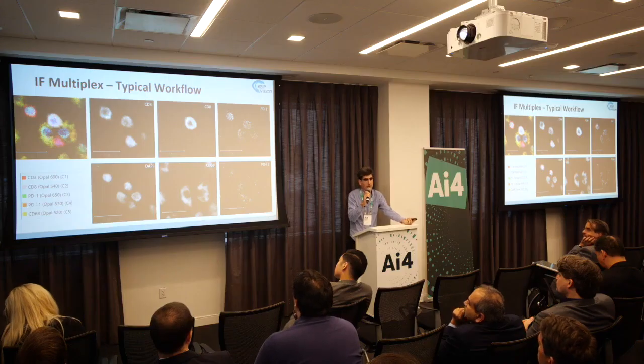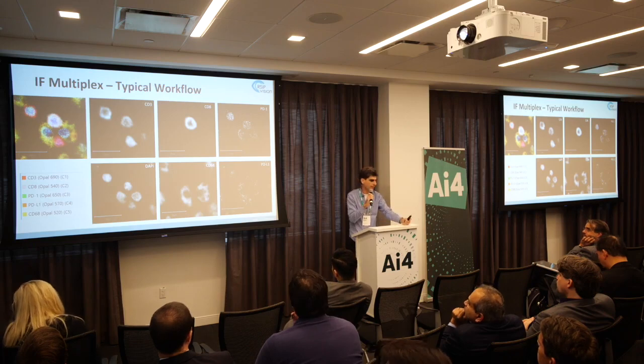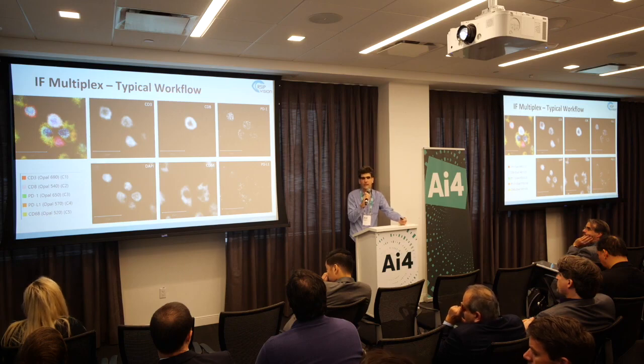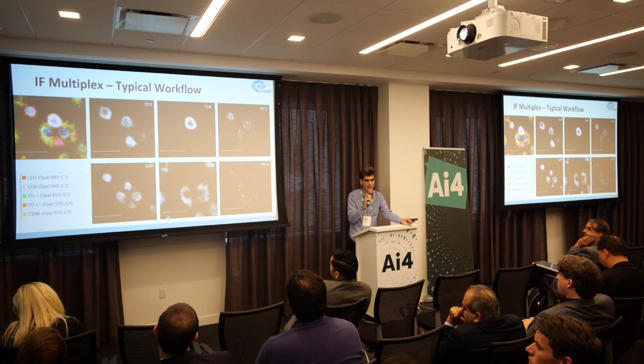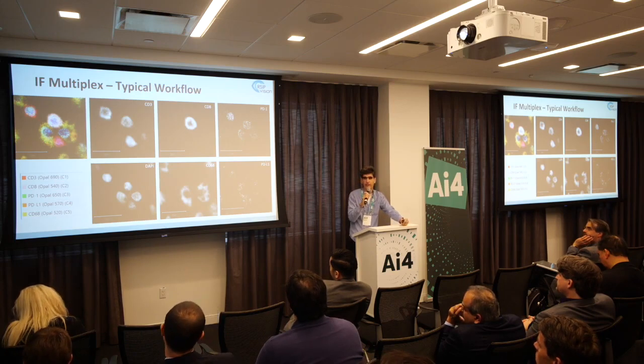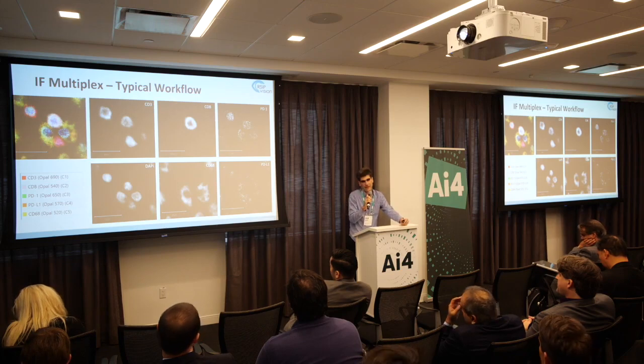In the past, the way this was done was by turning these intuitions of the domain knowledge expert into a set of rules. So you have a threshold in one channel, maybe an intensity, maybe a percentage, maybe some combination of both. You combine these channels and use it to classify these cells. If it's an easy case like that, then maybe a classical algorithm will work.